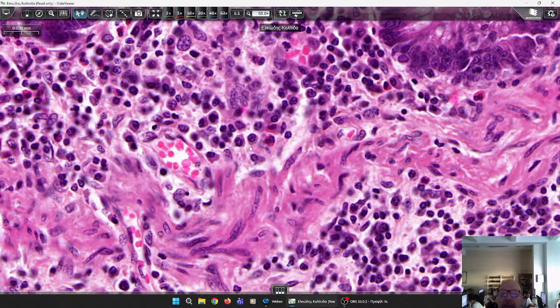So this basal plasmacytosis favors the diagnosis of an idiopathic enteropathy in the present case, taking into account the continuous involvement of the large bowel only and the confinement to the mucosa. This is consistent with ulcerative colitis.